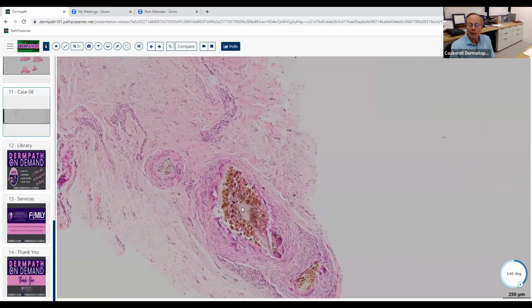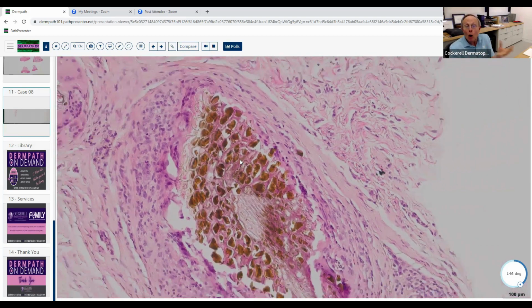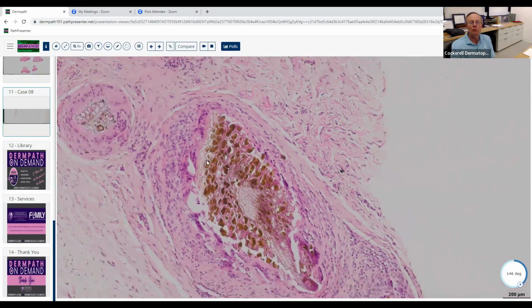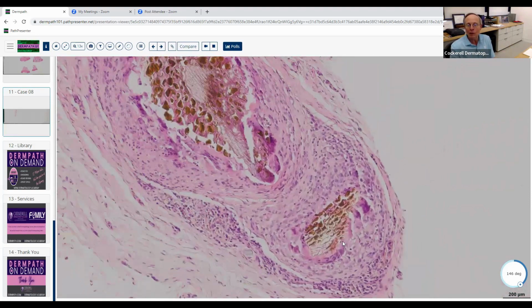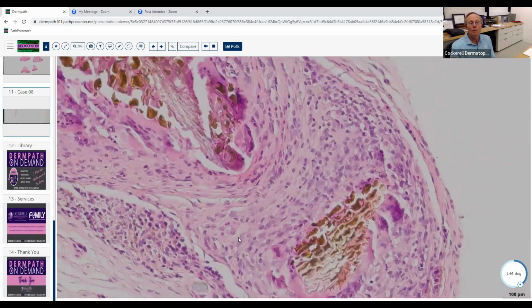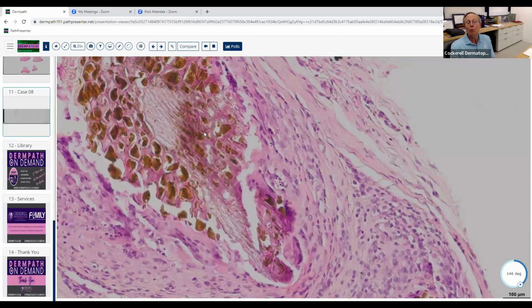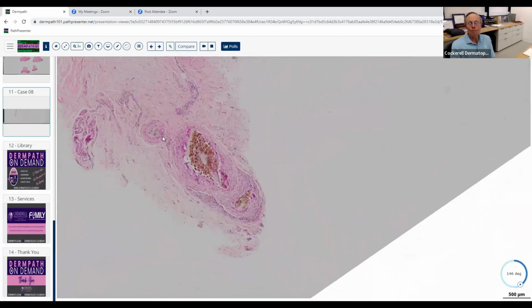They might ask you the differential diagnosis of what looks brown and dark like this. They might put in there something like a metallic foreign body. Well, you're right, you can see there's plant material here. They might put melanoma because it's brown or dark. So those are just some things they could put in there to try to fool you. But if you recognize that it's plant material, the cells here, these are the little cells of the plant. And probably the plant material looked kind of dark. Might have been a rose thorn in a patient that was a gardener. So this is a splinter.